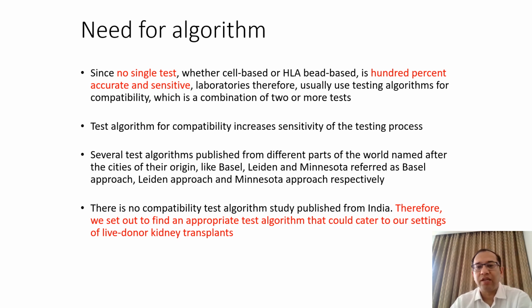A testing algorithm increases the sensitivity, and there are several algorithms available, like several approaches in different parts of the world, like Basel, Leiden, Minnesota, and all of that can be recapitulated. We can do it here, but we don't have our own algorithm based on the settings and the factors that we have in this part of the world.